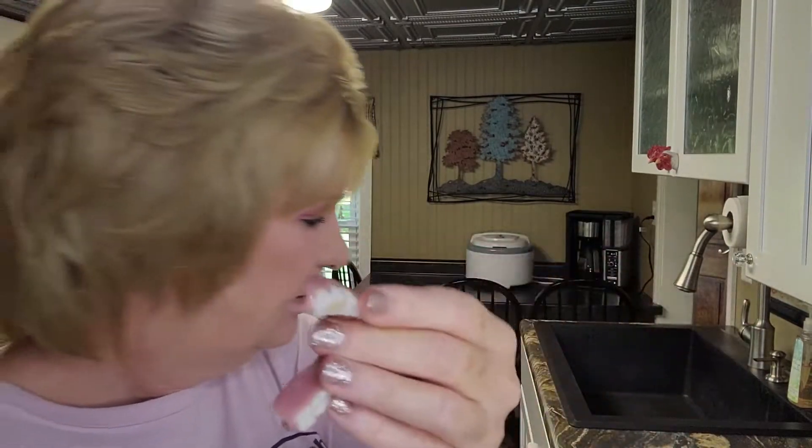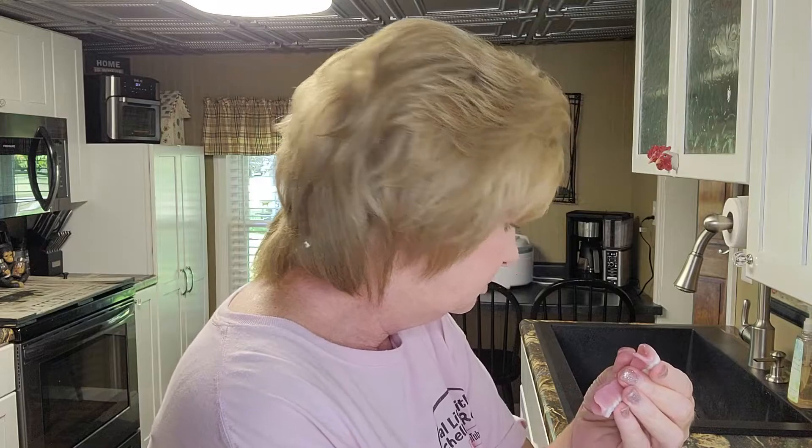You can see how the Dr. B brush splits up and barely touches the inside of the trough. Let me try the Walmart brand — oh yeah, I like that better. The GUM brand is okay. The Amazon brush gets in there too and it's much softer.